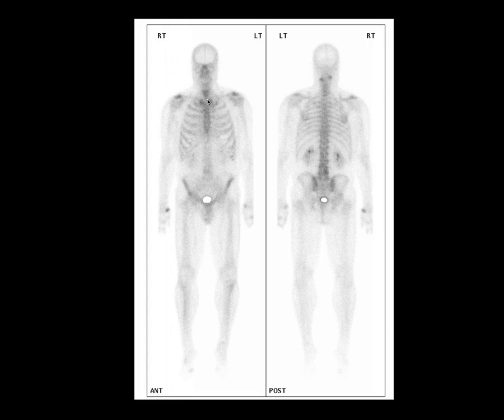There's also this triangular-shaped area of activity in the lower neck on the anterior view. The technetium methylene diphosphonate tracer is not perfectly manufactured — a little is left behind as free pertechnetate, unbound technetium, which will pass principally to the thyroid gland. So it's a contaminant or by-product we can see on the examination. The important thing is not to confuse it with anything else.